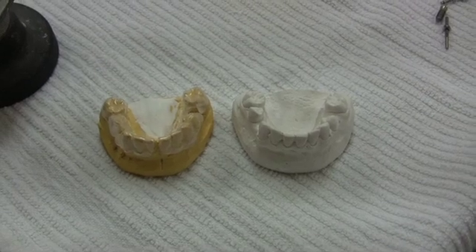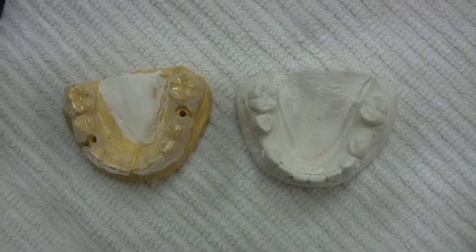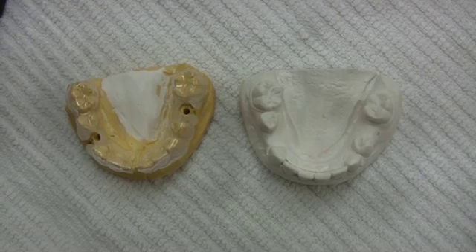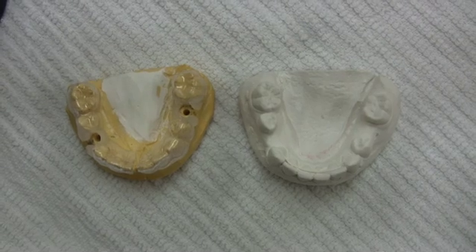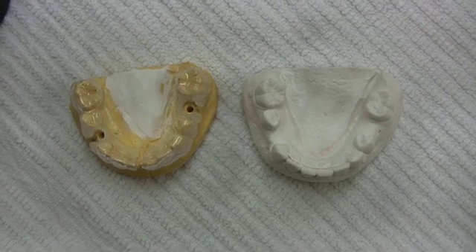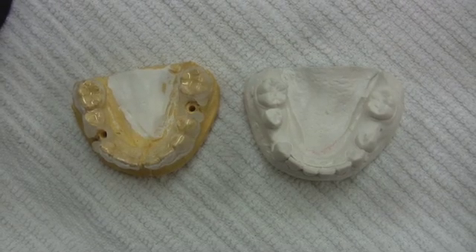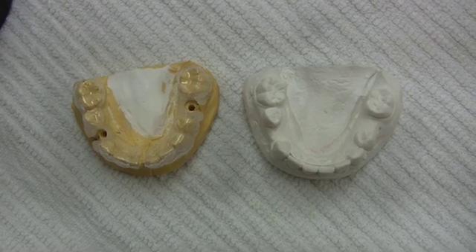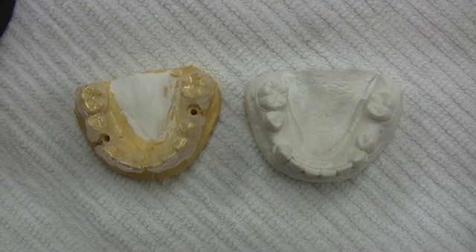On the guide you will notice an acrylic channel which controls the axis of the planned implant in the buccal-lingual and mesial-distal dimension. The third dimension, the vertical, is controlled by my drill stop. This channel is formed around a stepped pin which is slightly larger in diameter than my drill stop.